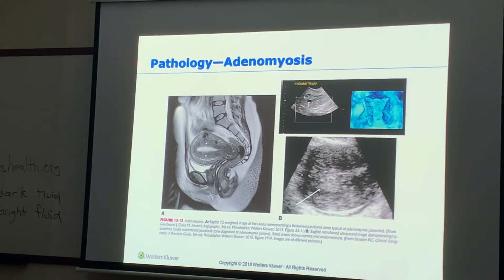So here is, what view is this of the uterus? Sagittal or transverse? It's sagittal. It's sagittal. Because on some women, the fundus of the endometrium will be bulbous. Okay? Here's towards the lower uterine segment. Here's toward the fundus, anterior body, posterior body. Okay? See how anterior body is beautiful and homogeneous? Look at the posterior body. It's not.